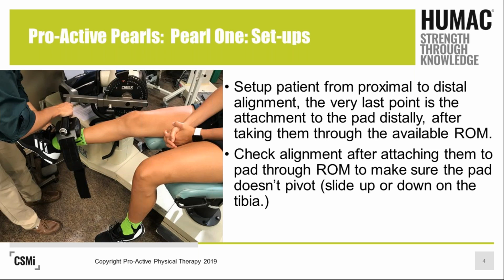Some people think 2 to 3 finger breadths above the medial malleoli, or 5 centimeters above the medial malleoli, is a great position. Others believe that we can change that to go up or down depending on the amount of stress that we want. And we'll talk about that a little bit also.